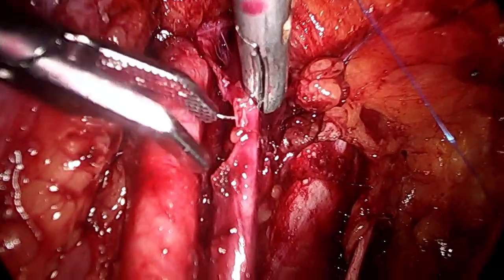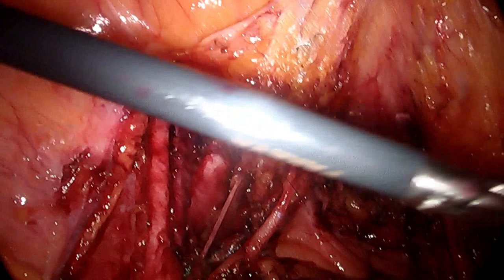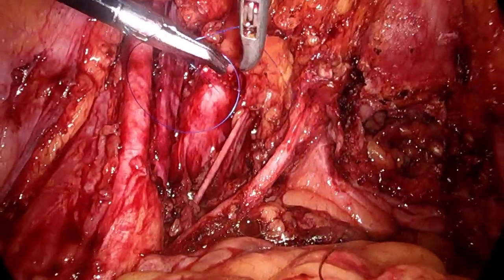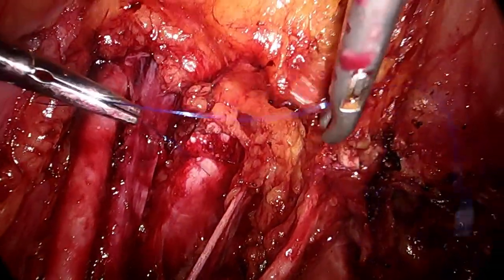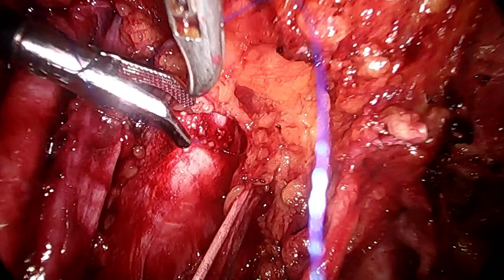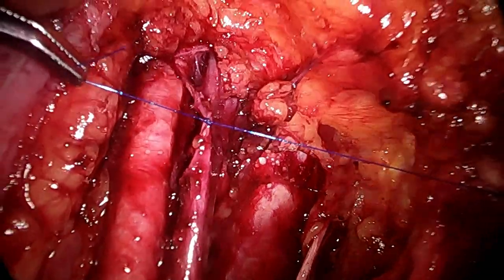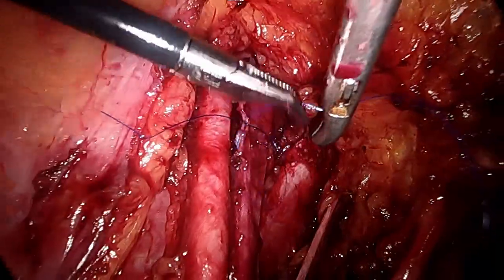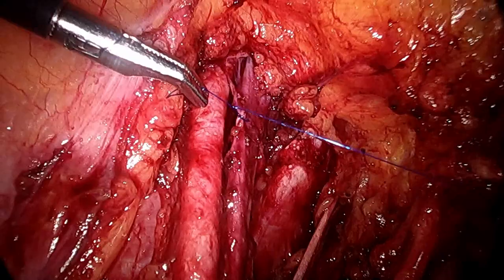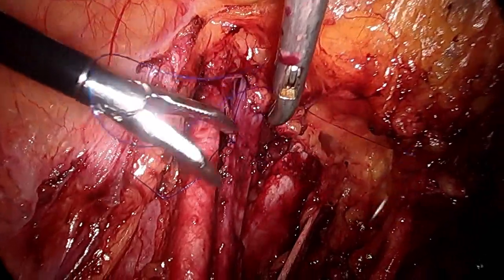For doing the venous repair, you have to be very careful not to create a puncture injury to the external iliac artery, because injury to the external iliac artery can be disastrous as the bleeding may be too much to handle. You can use a very small size prolene — in this case we are using 5-0 prolene on a round body needle — and we are just giving simple stitches to close the rent. It is a very small rent, approximately 2 to 3 mm, and we are giving just 2 stitches to close it, then checking for any leak from the rent.